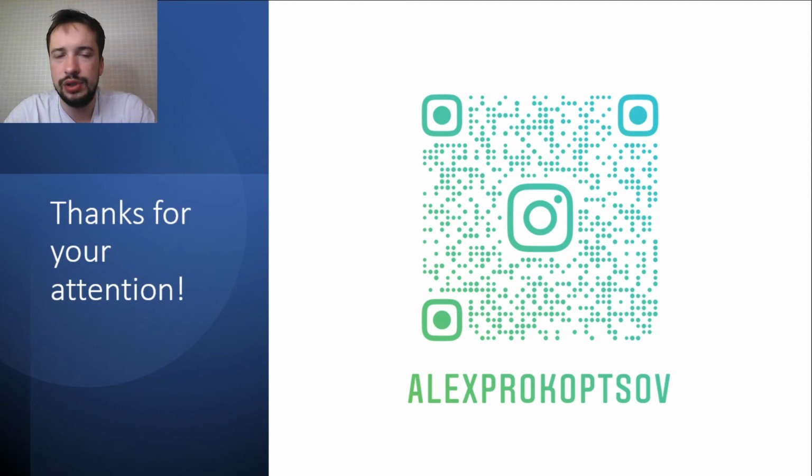That's all in this small classification. You need to know all these instruments, and it's important to know them because you will work with them. Not all of you, of course, but all of you will work with, for example, one or two instruments from this checklist.